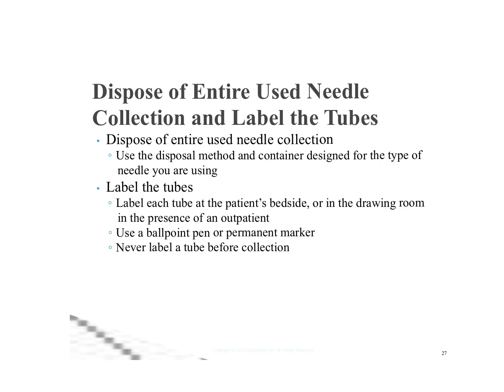The entire collection set needs to be disposed of. So use a disposal method and container designed for the type of needle you're using. Again, we're going to be using those red sharps containers. We aren't going to disassemble it or anything. We're going to throw the whole thing in, okay?